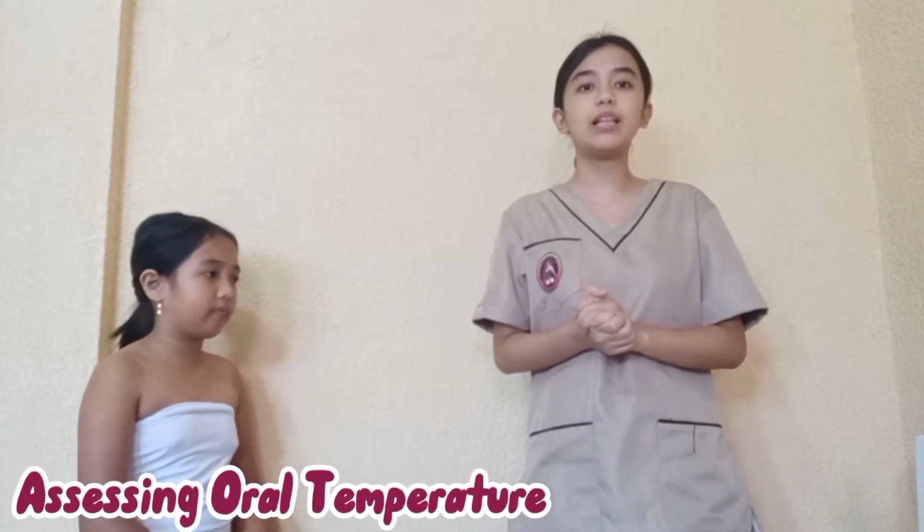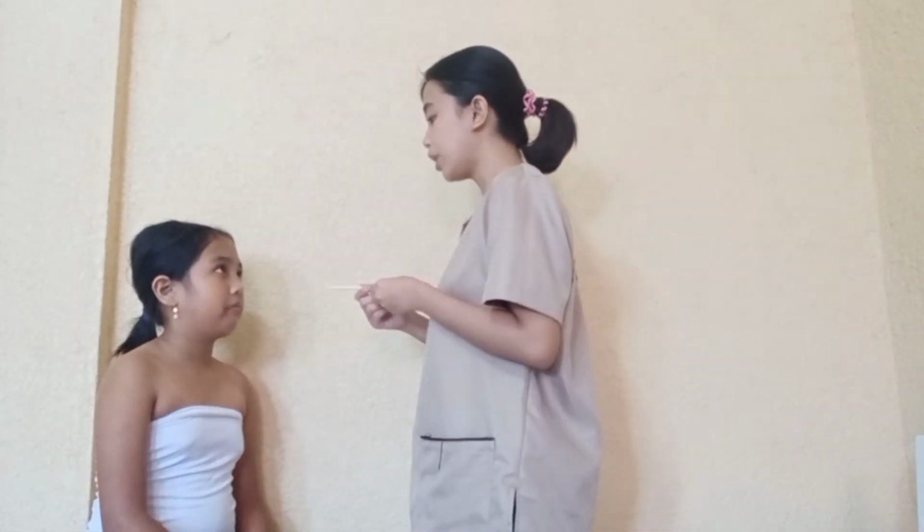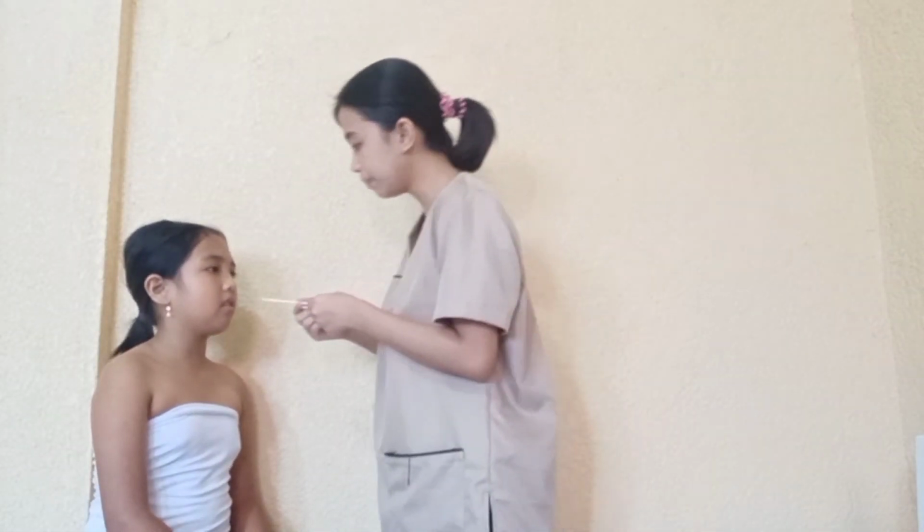I'm going to remove the electronic unit from the charging unit and remove the probe from within the recording unit. Assuming that this is an oral thermometer, the next thing I'm going to do is to cover the thermometer probe with a disposable probe cover and slide it on until it snaps into place. Next, I'm going to place the probe beneath the patient's tongue in the posterior sublingual pocket. So ma'am, is it okay for you if I insert this oral thermometer beneath your tongue? Okay, ma'am?